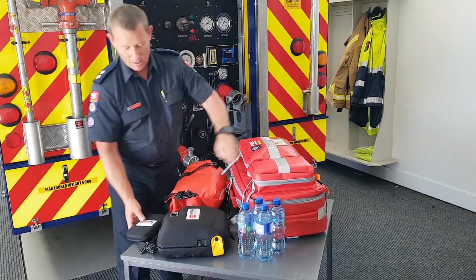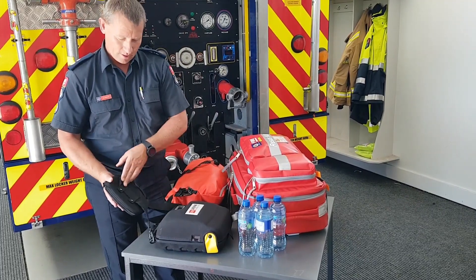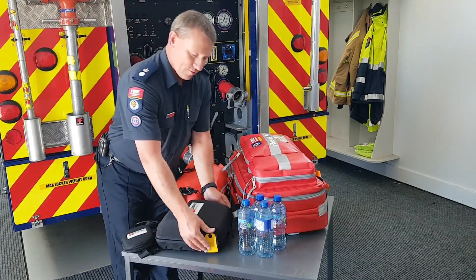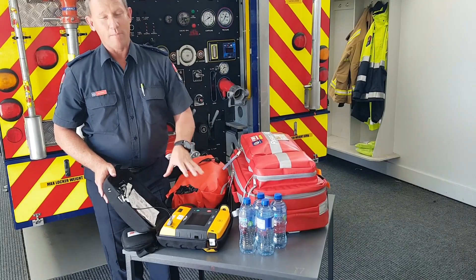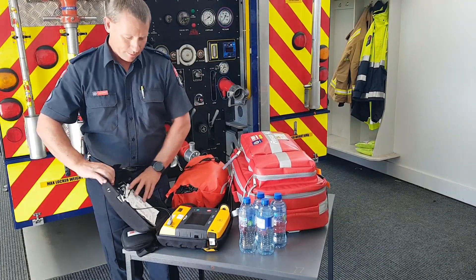Just a pointer on the AEDs: this is the monitoring AED and it has the pouch on the strap — it's the only way you can tell the difference. We'll have to sort this out, but the LifePak 1000 monitoring looks absolutely identical to the standard LifePak 1000, so it's really important that they don't get mixed up.